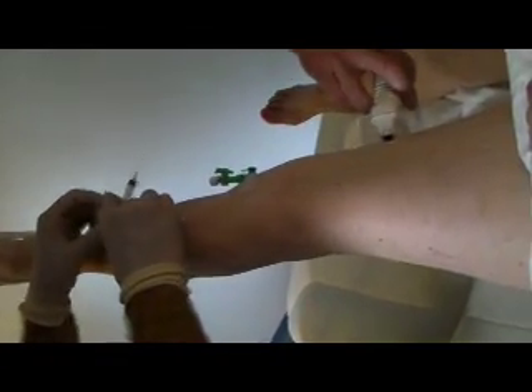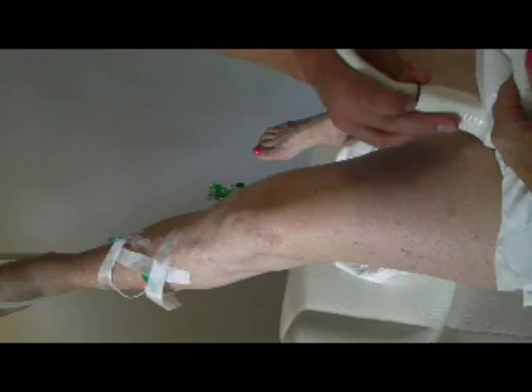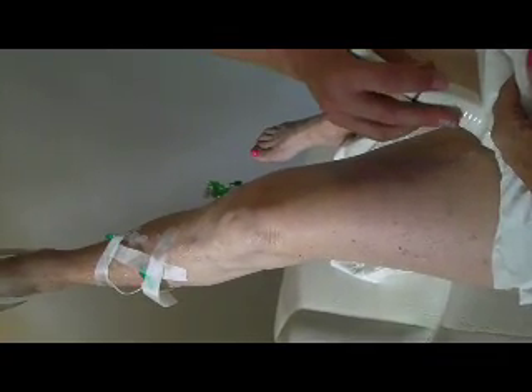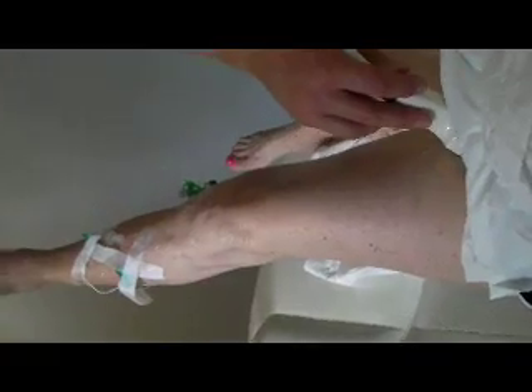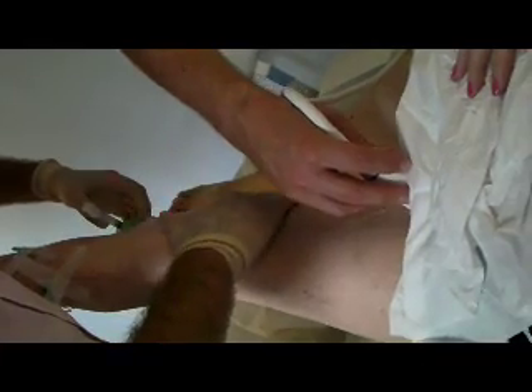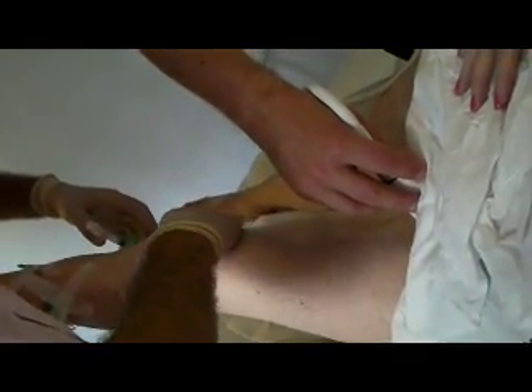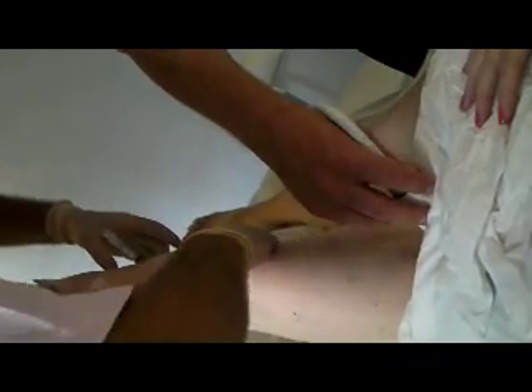Once the small veins have been treated using the butterfly the larger vein is then treated. This has sometimes gone smaller because of the previous treatment. Once again this is a combination of injecting and scanning to ensure that the chemical has gone into the right place. You'll see in this clip that the scientist is holding the probe right up in the patient's groin, and this will be to compress the junction of the great saphenous vein and the common femoral vein. This ensures that the foam stays in the correct place and therefore treats the veins that are affected. You'll see here that the doctor is pushing some of the foam up and down the thigh within the vein and then back down again into the tributaries that it's feeding. This is a way of getting complete treatment.